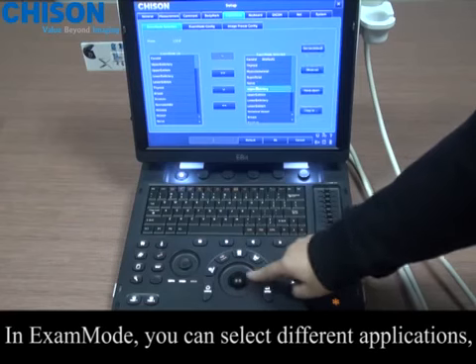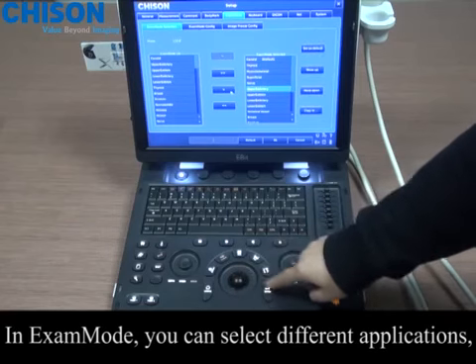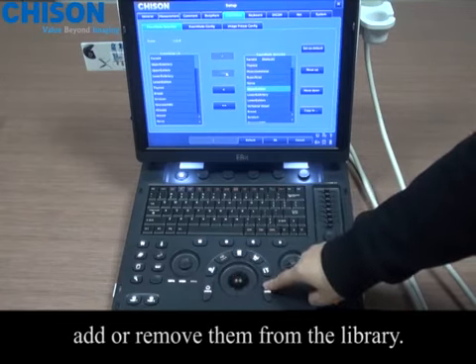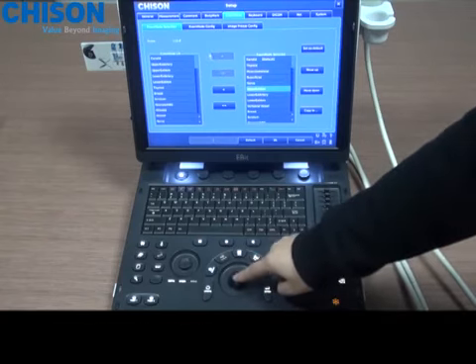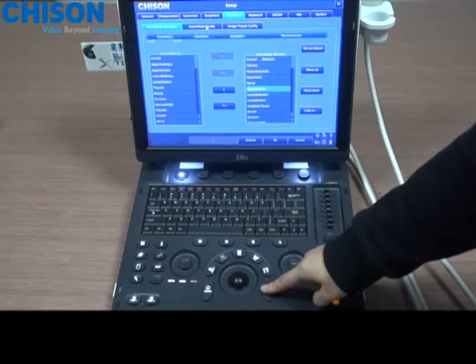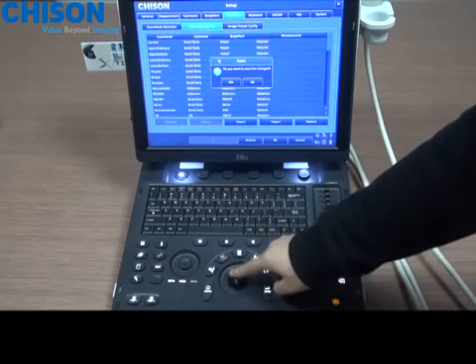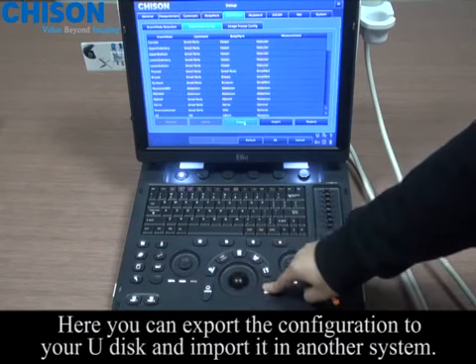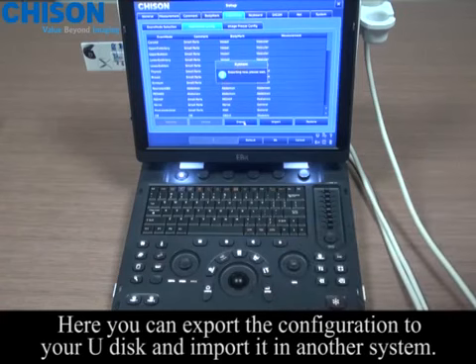In exam mode, you can select different applications and add or remove them from the library. Here you can export the configuration to your USB disk and import it in another system.